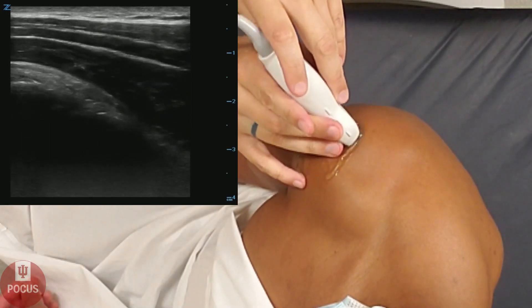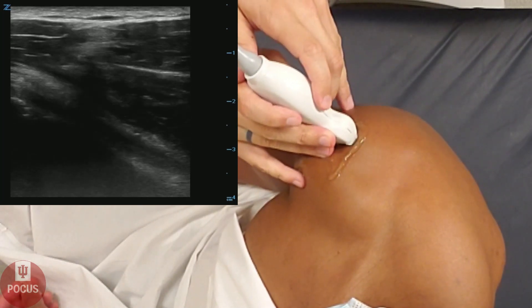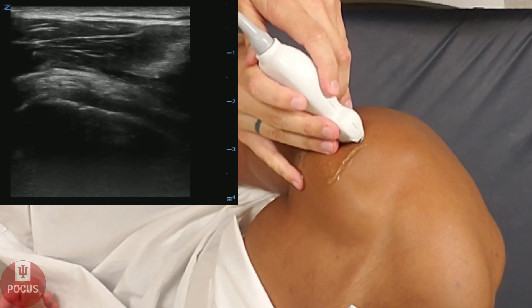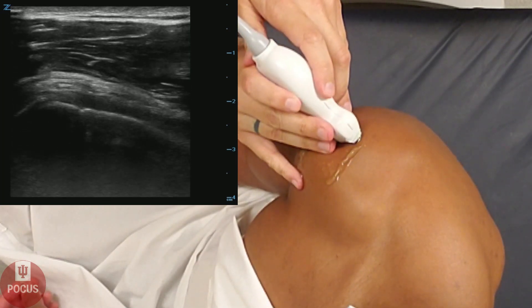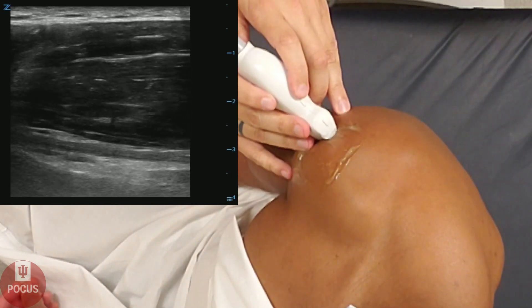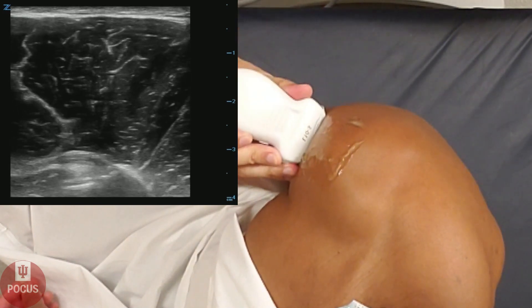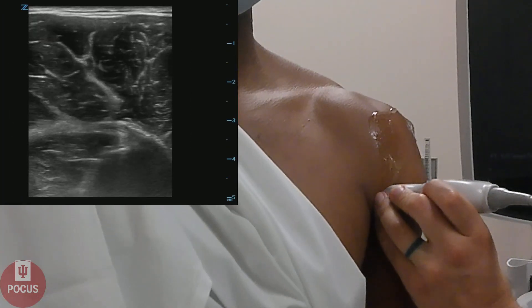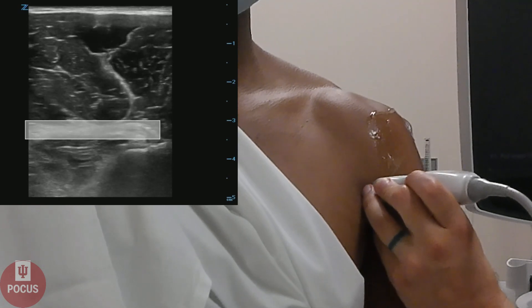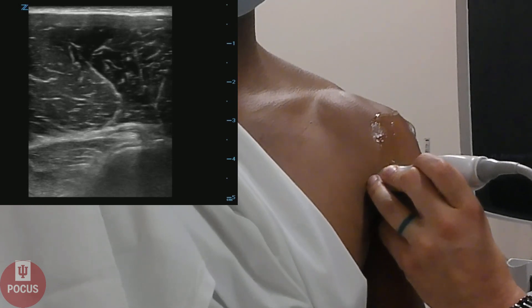Then we can rotate 90 degrees on that tendon to determine if the tendon is completely there. We'll look at this in long axis. The tendon is going to be between the greater and lesser tuberosity, so you just move lateral and medial until you find it, and then follow the tendon down to the myotendinous junction. Here we'll rotate 90 degrees and see the pectoralis major tendon in the middle of the screen as it inserts onto the humeral head — see if there's any ruptures or tears within the pectoralis major tendon.